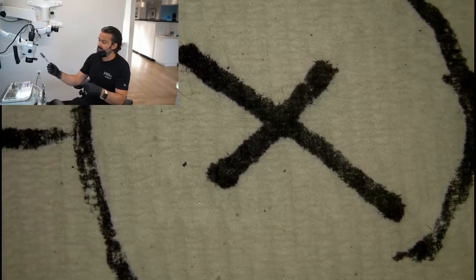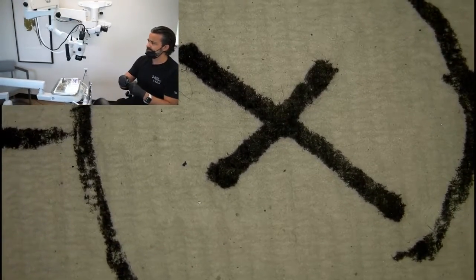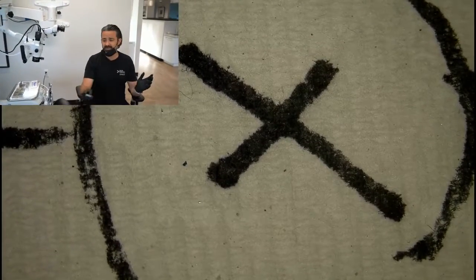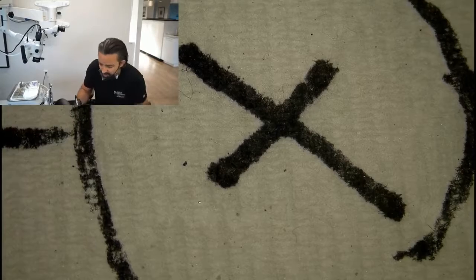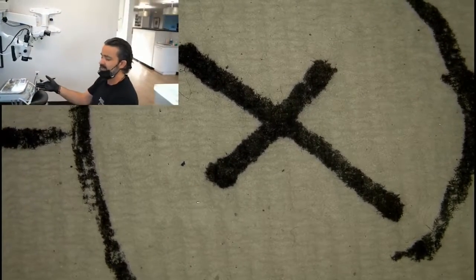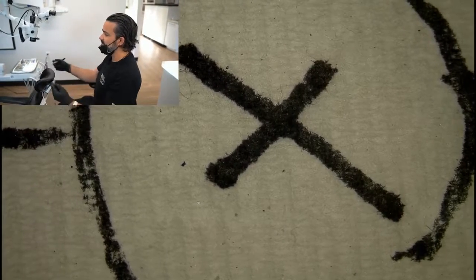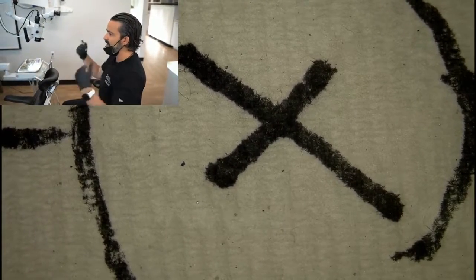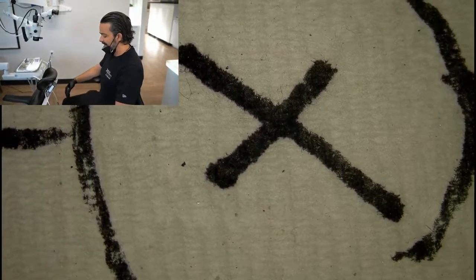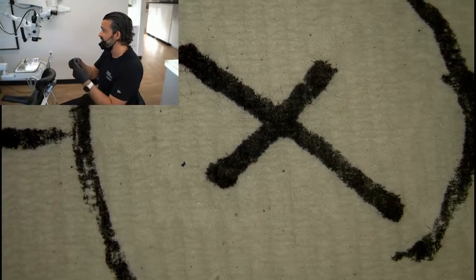So first and foremost, pearl 1 is this fine focus. The second thing, I would say, is position. When you get comfortable, like I was describing with Lindsay in the chair, just working in this 12 o'clock position, it's just more comfortable to then use my mirror and keep my posture correct. I think if you're having neck or back problems, that's something that is a huge advantage, a huge plug for the microscope.